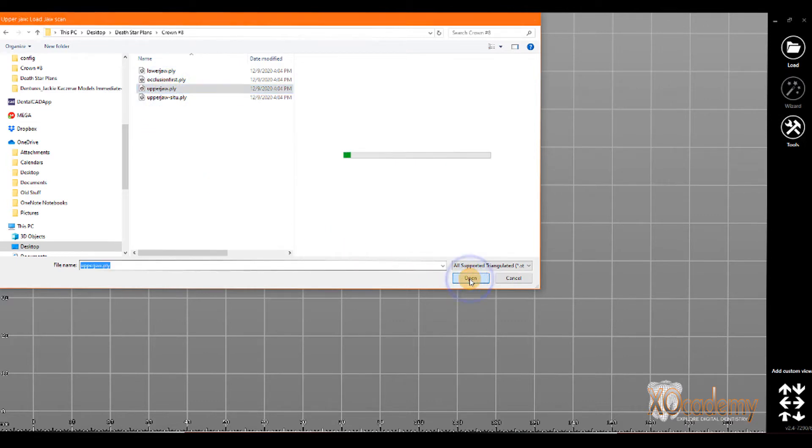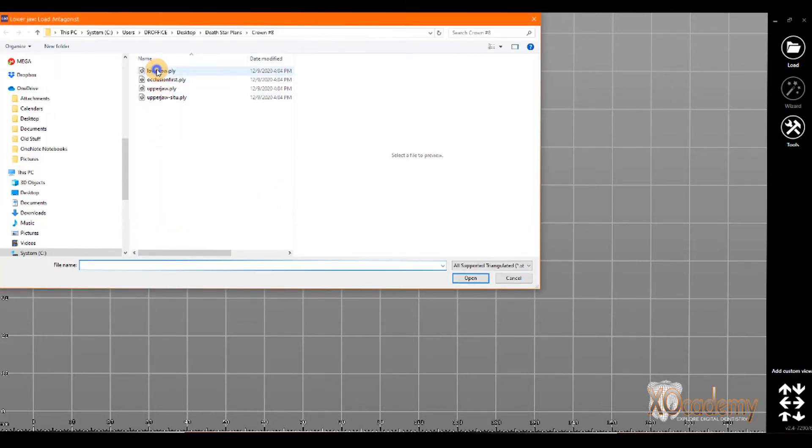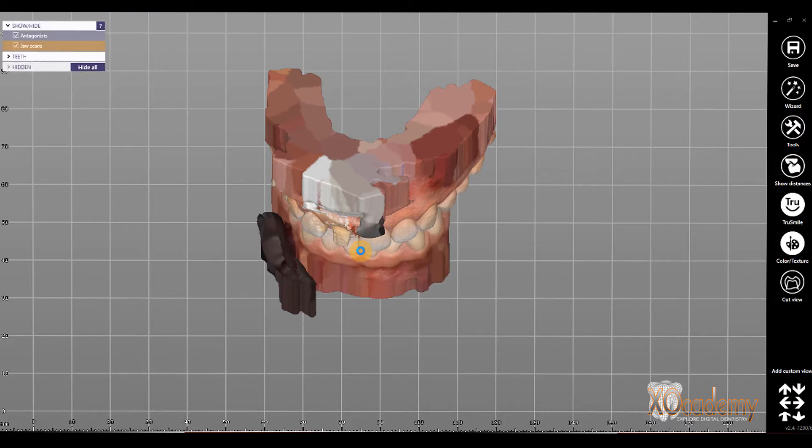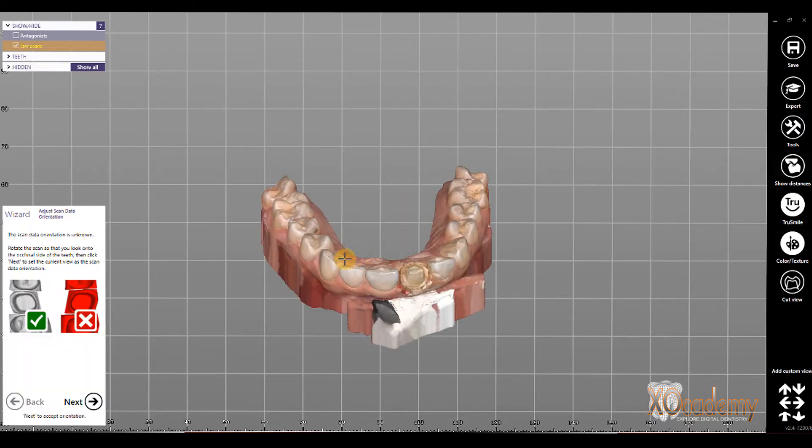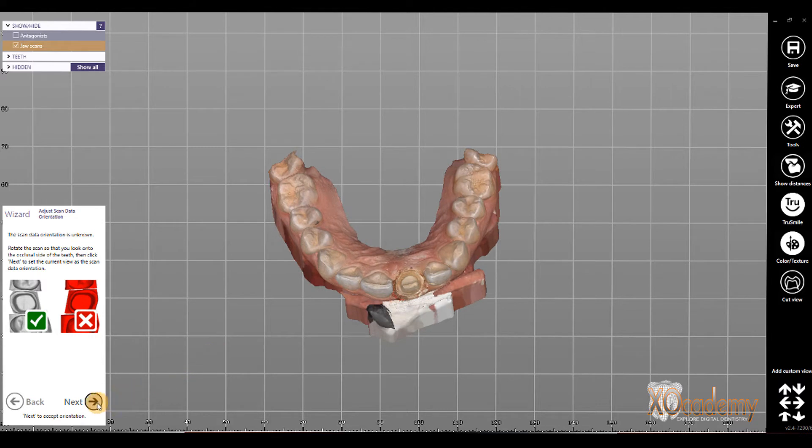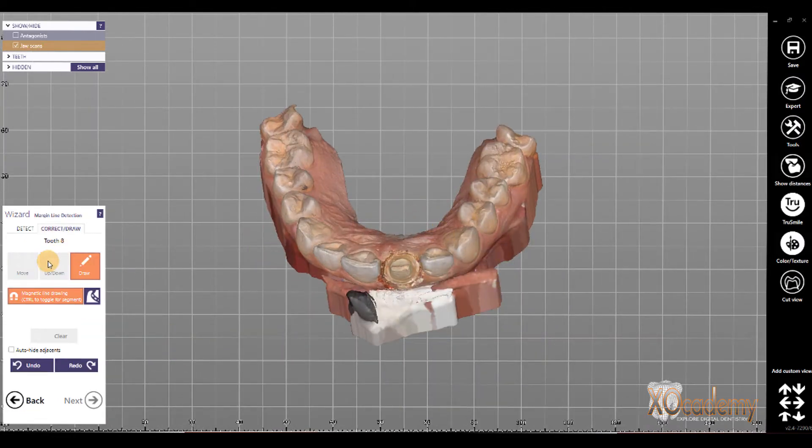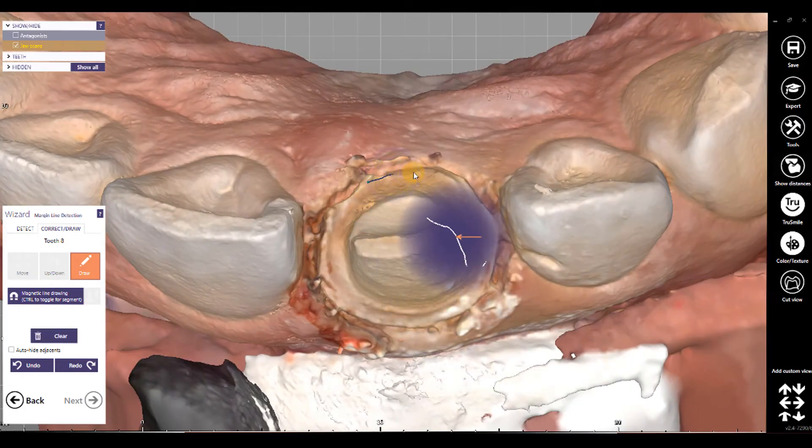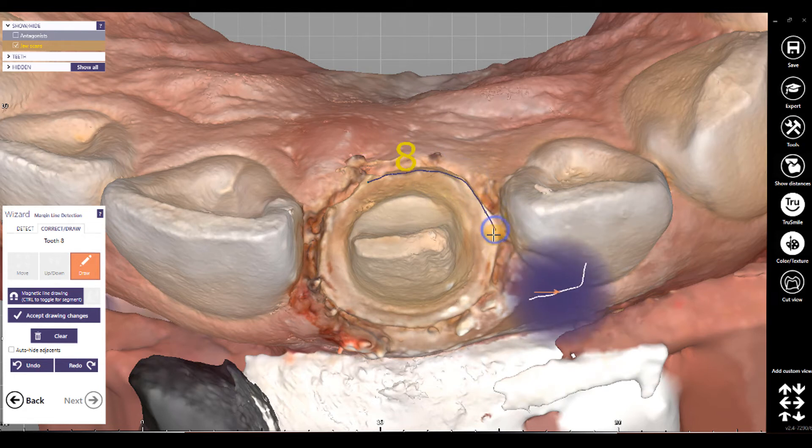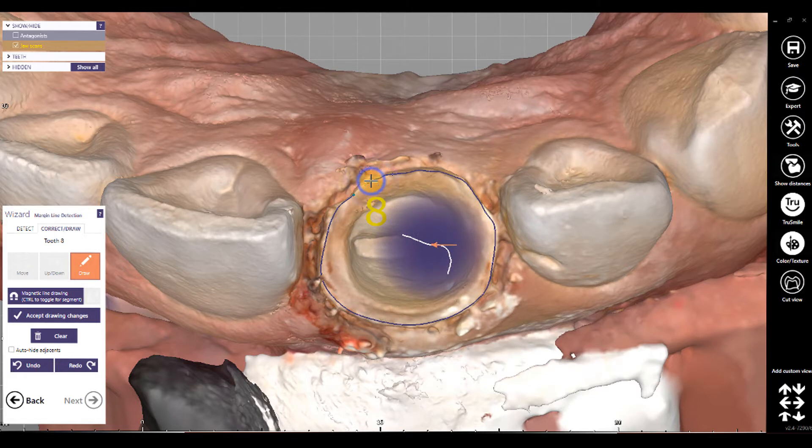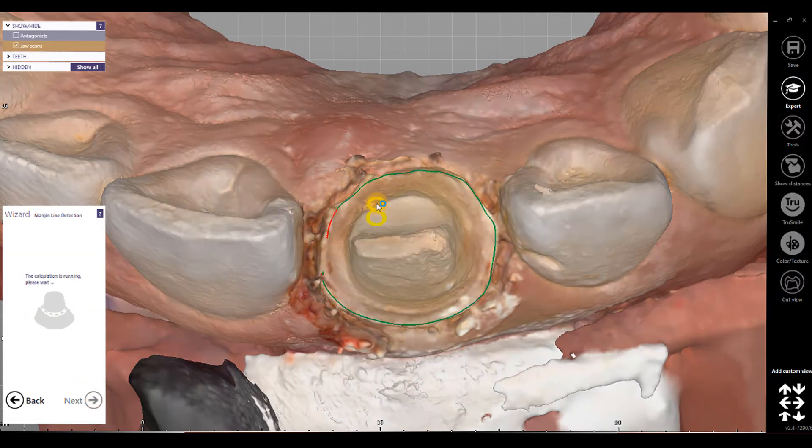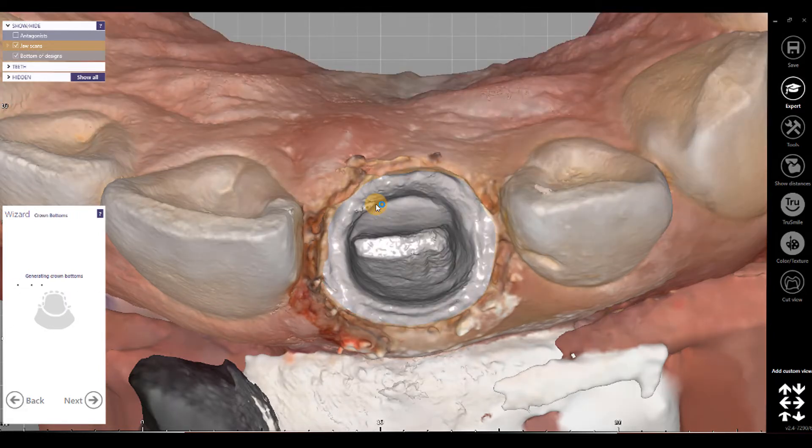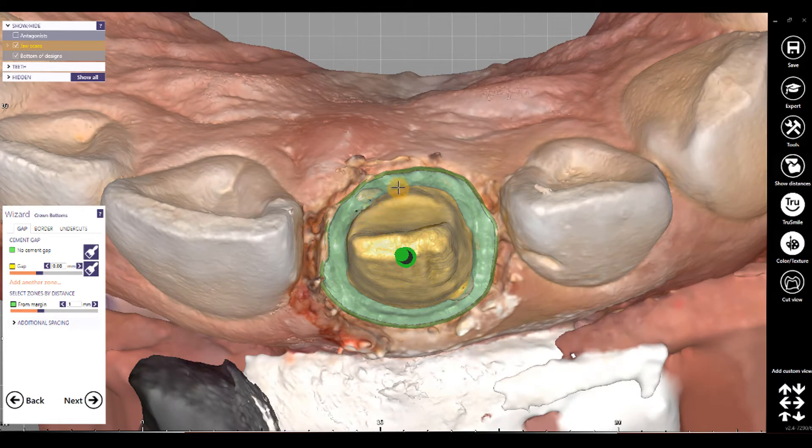So, we start DentalCAD, and I'm going to load our scans for crown on number 8. We'll load the upper jaw, and then load the lower jaw. Set our orientation, and draw our margin. In this case, I'm not too concerned about the margin. I just want to show you, I want to get that crown designed so I can get to the settings that I'm talking about.